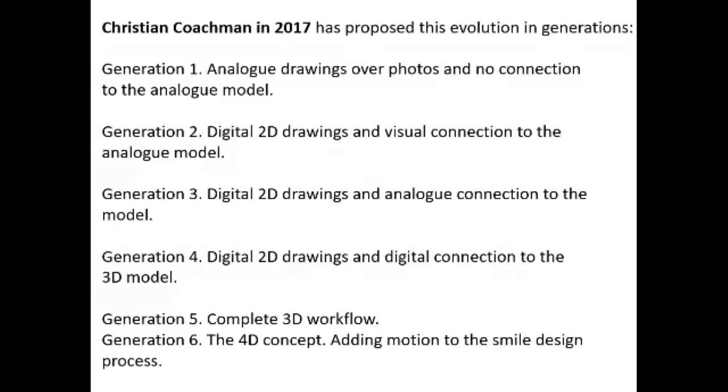According to Christian Coachman, he has proposed a few evolutions in the generations of digital smile design. Generation 1 is just the analog drawings, the handmade drawings over photos, and there is no connection with the analog model, the impression, or the final master cast we get from the patient. There is no correlation. They just take a photo, use handmade drawings over it, and compare to get a good result. But this was a very primitive way of doing the smile design.